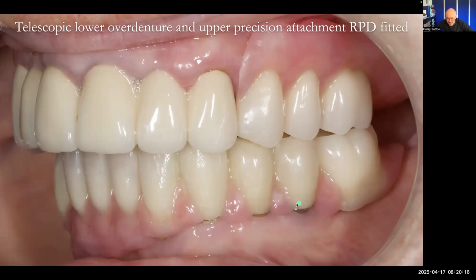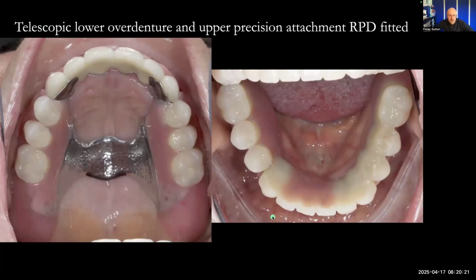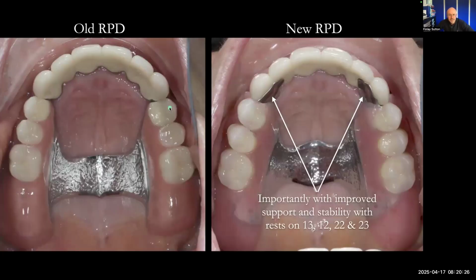This is the lower fitting. You can see it just fitting beautifully down onto those gold abutments there. So that's the denture, with our lovely bracing elements on there. I know I've been harping on about this, but I think it's really, really important. This is the old RPD, and they do put a lot of force on this anterior bridgework. Now, it is all linked, so that's going to reduce that, but I just think having these extra little struts there is going to really help with that.